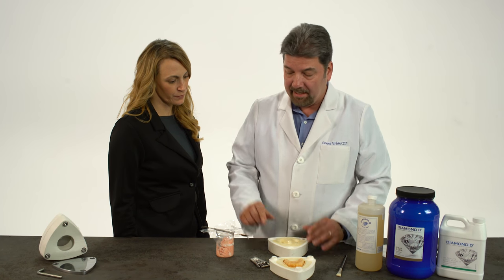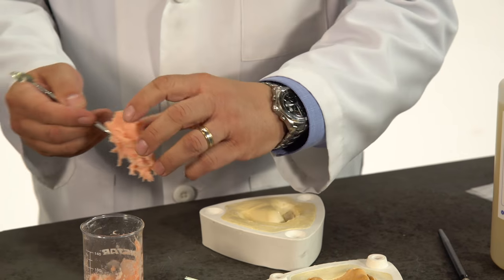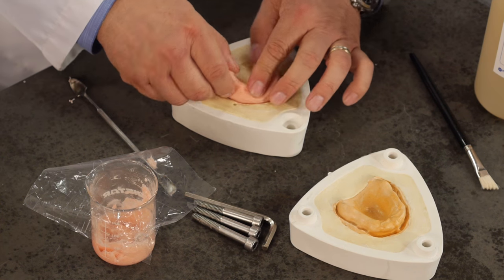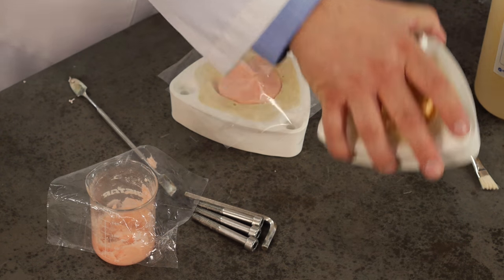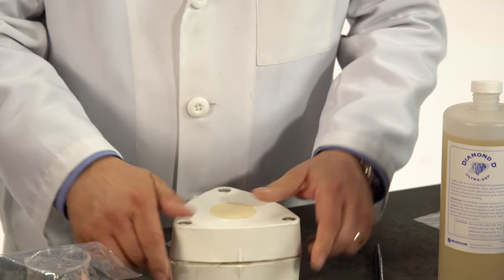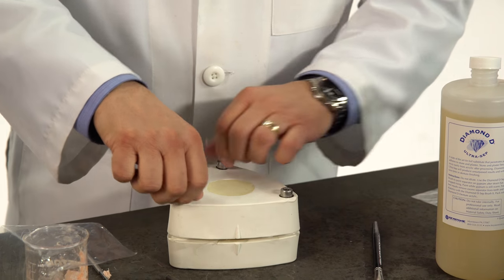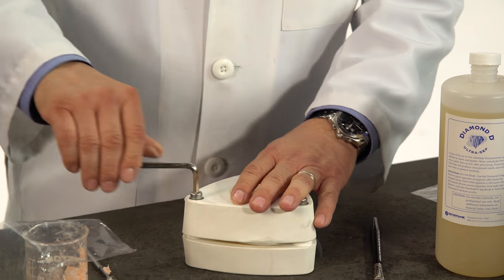Our acrylic is mixed and we're ready to pack the denture now. As you can see, the acrylic is to a doughy consistency here. I'm just going to put a little bit in the flask around the teeth and over the pallet area. Now we're going to take these plastic sheets — I use two sheets. This enables me to open the flask easier when I'm trial packing. At this point now, we want to close the flasks. Make sure that these notches match up, otherwise the flask won't close easily. We place our bolts back in the flask and we start tightening them down — bring them down slowly. This eliminates trapping any air bubbles.